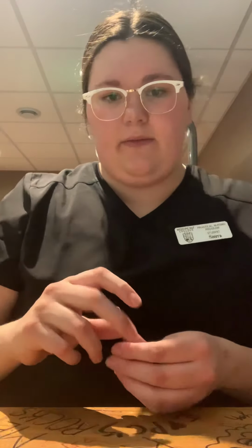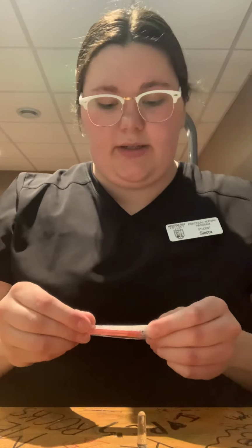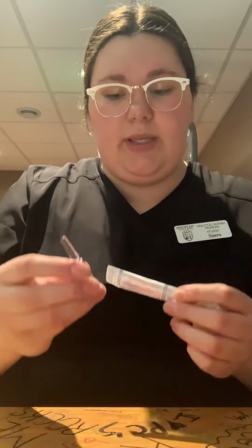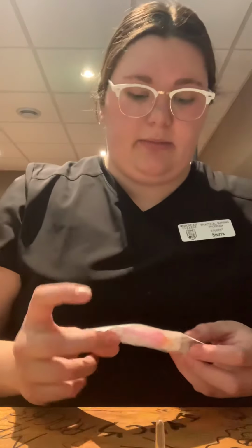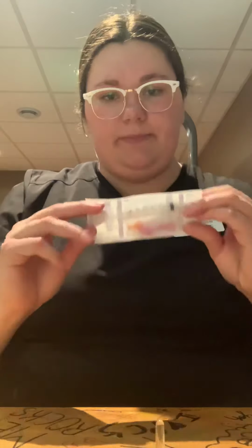So when preparing morphine, morphine comes from an amp. So we have our 1 milliliter amp that we will be using. We have our blunt fill needle filter. We have to use a filter needle because this is glass and we will be breaking the top open. So in case there is any glass shards in there, we need to make sure we are filtering those out. And then we have our needle and plunger. So our 3 milliliter 25 gauge needle that we will be using.